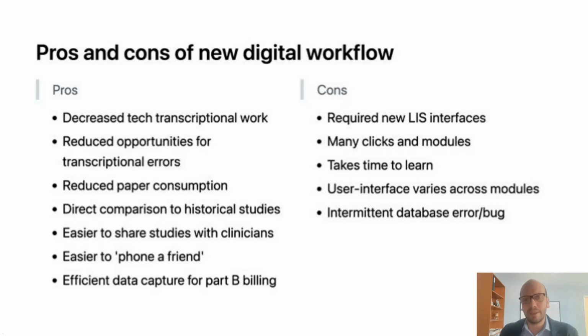And then another unanticipated benefit was we were able to set up some very efficient data capture mechanisms in order to facilitate our Part B billing for our interpretations. And I'll talk about this a little more in a following slide.